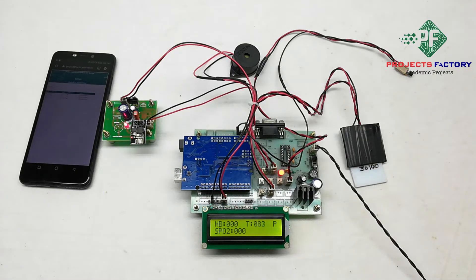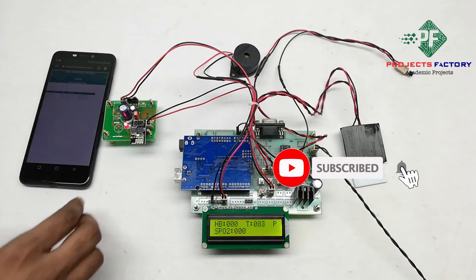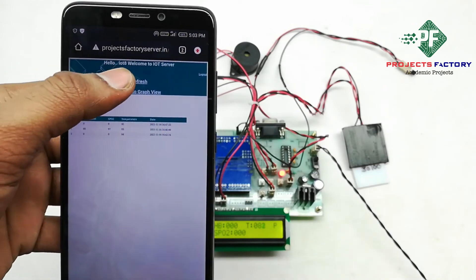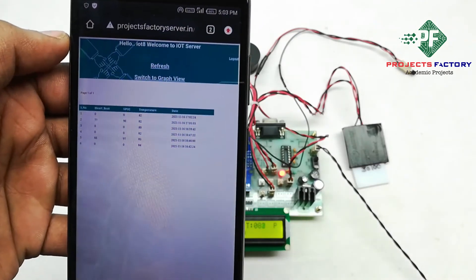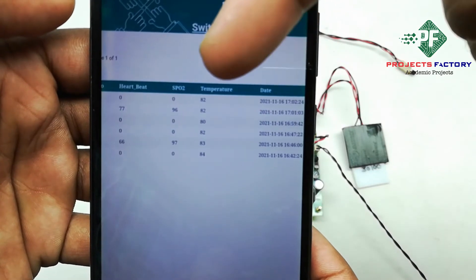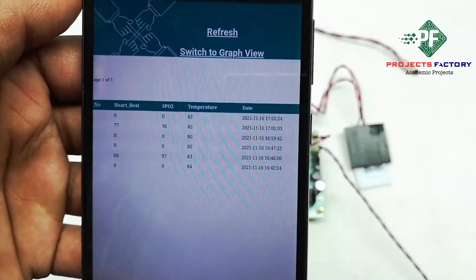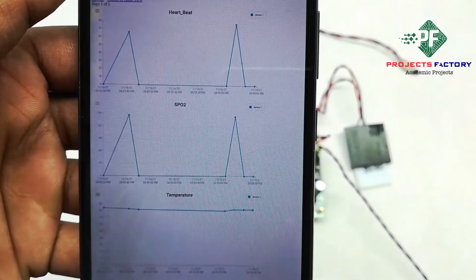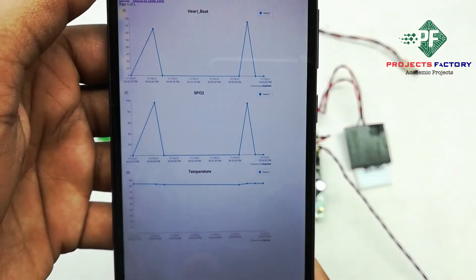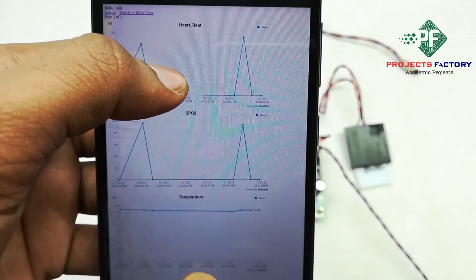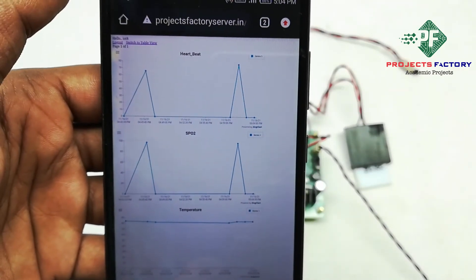In the server, we can see the data in a table with respect to date and time, showing heartbeat, SPO2, and temperature values. We can also switch to graph view to visualize the data graphically.